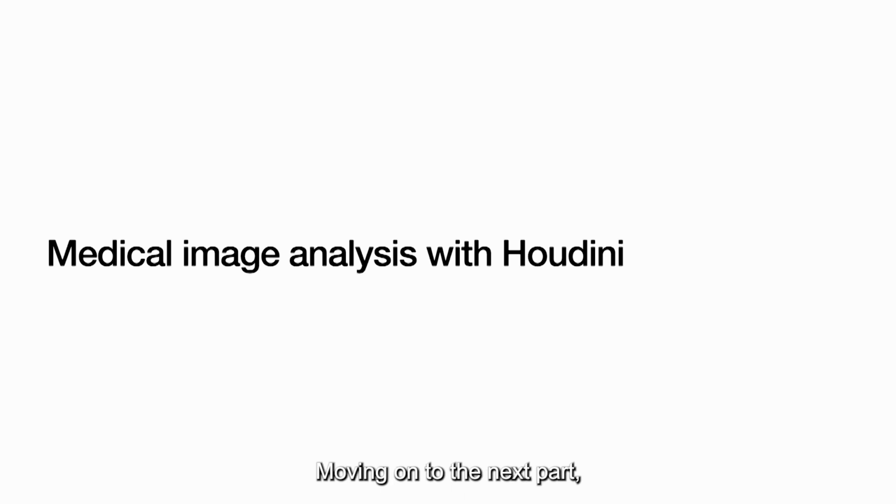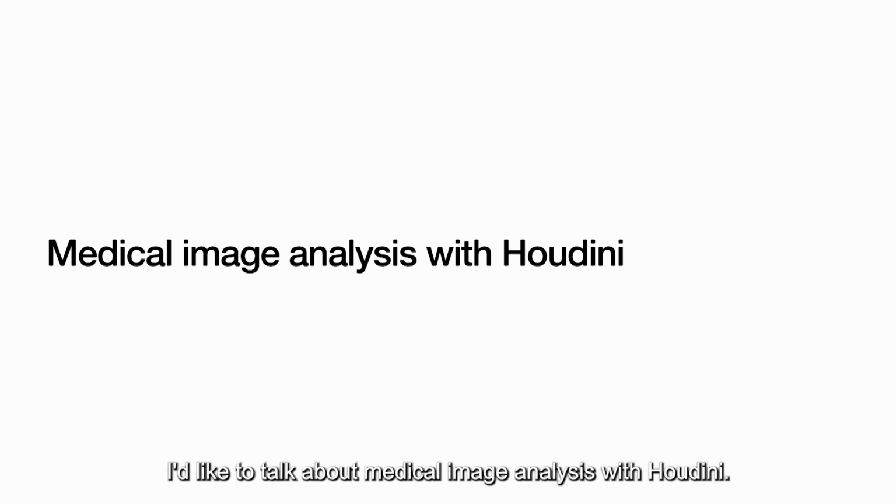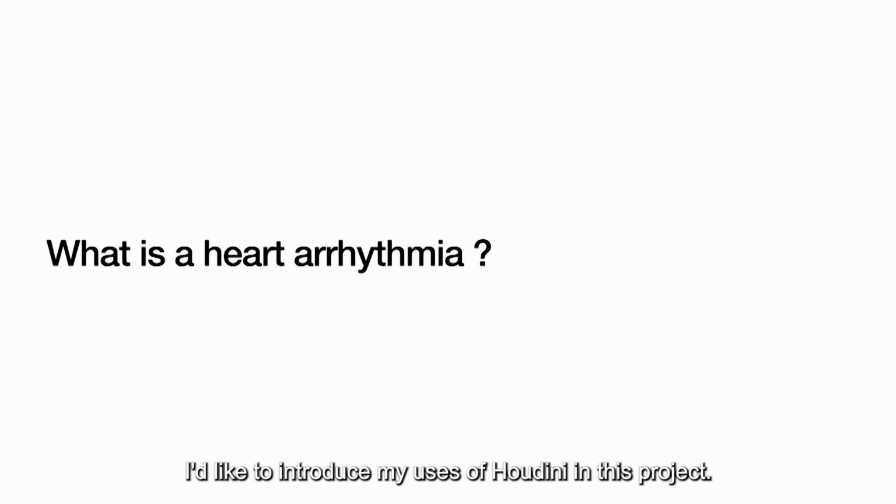Moving on to the next part, I'd like to talk about medical image analysis with Houdini. As I mentioned before, I participated in a medical research project at Tokai University. In this project, I analyze medical images of heart arrhythmia patients. I'd like to introduce my uses of Houdini in this project.